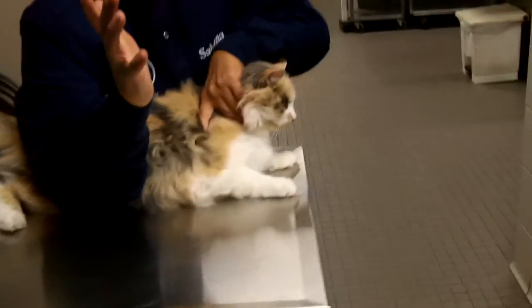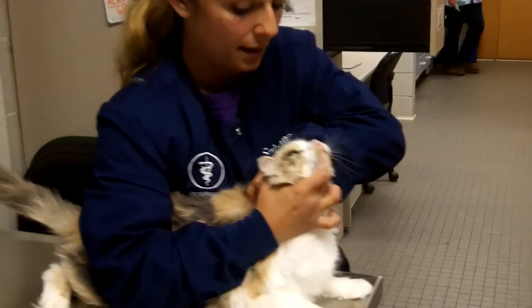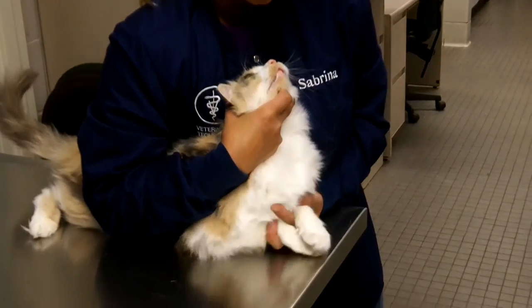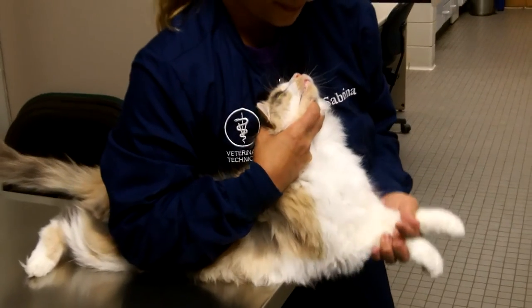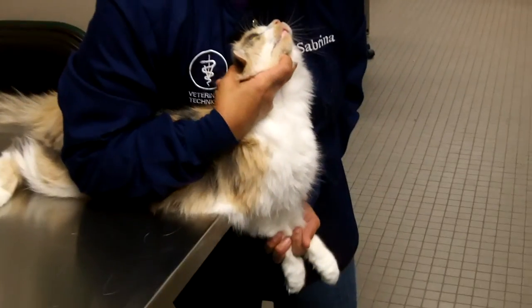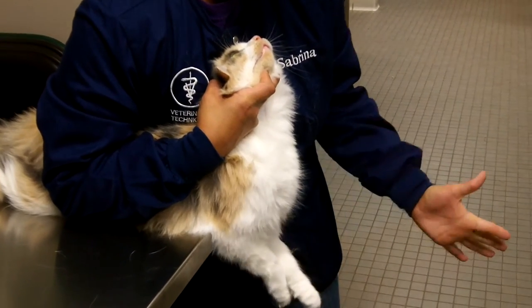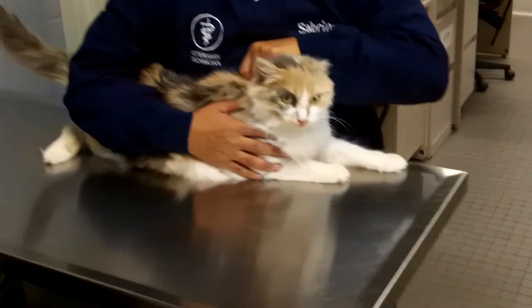Now I'm going to restrain her head with my right hand — grab, lift, get her centered, grab her paws, run her over the table. It's okay, sweetie. And then once the draw is done, I can let go with my left hand, restrain her head, and come back.